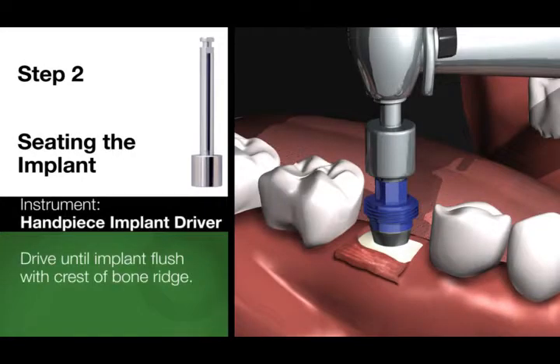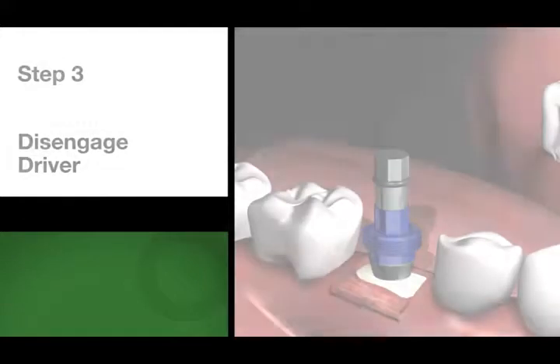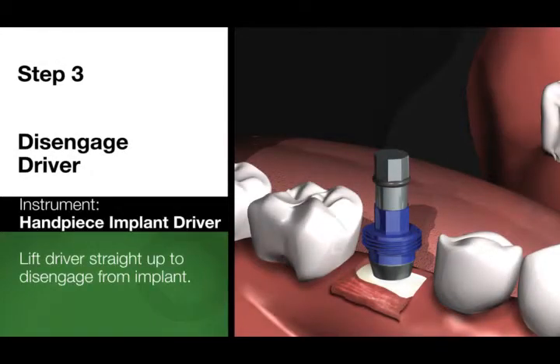Step 2. Seating the OCTAGON implant. Drive the implant until it is fully seated and flush with the crest of the bone ridge. If the implant does not seat at 35 Newton-centimeters, back the implant out of the osteotomy. Place the implant back into the sterile vial and refer to the optional dense bone protocols for the appropriate implant diameter.